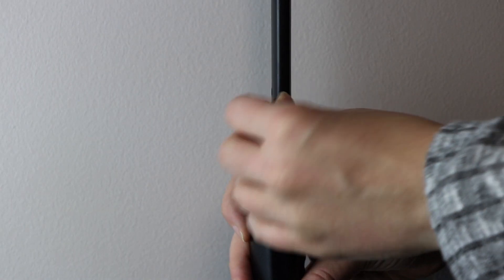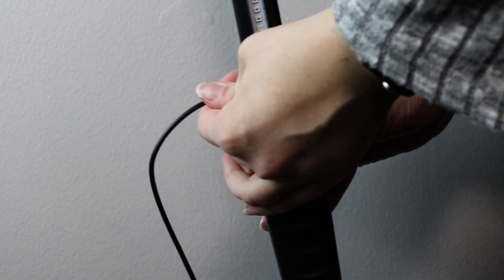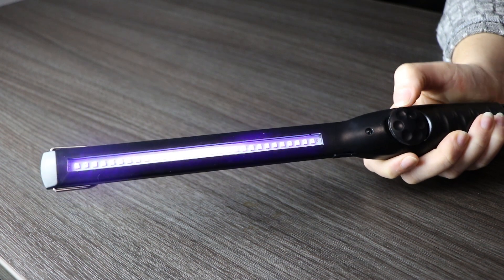Before using the wand, make sure it's charged. Once you're done charging, be sure to don your UV-rated safety glasses. Once your eyes are protected, turn the round dial on the front clockwise until you hear it click.